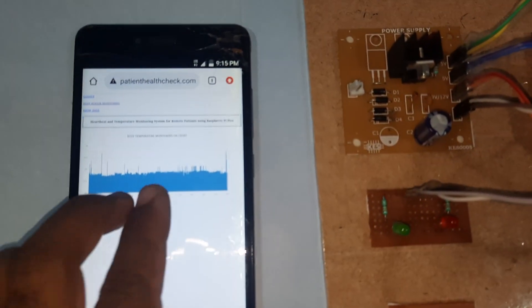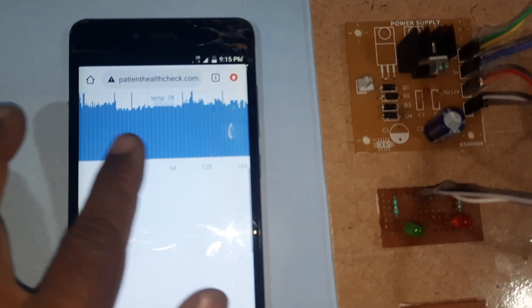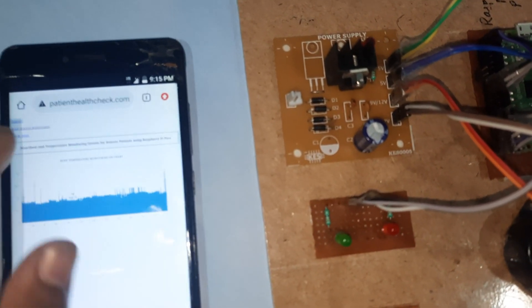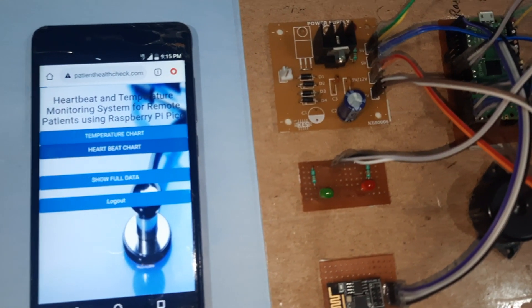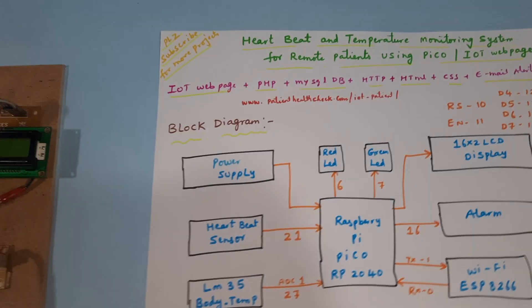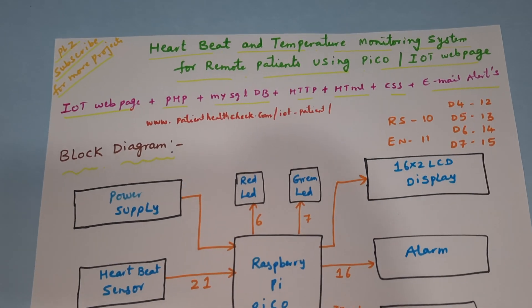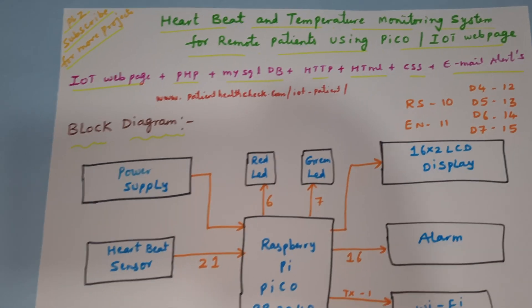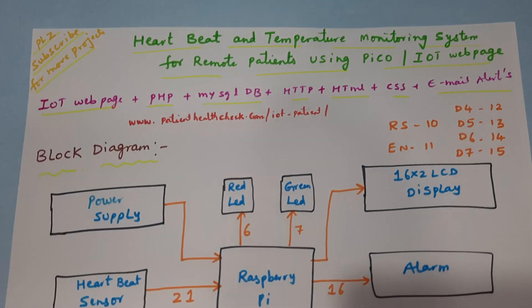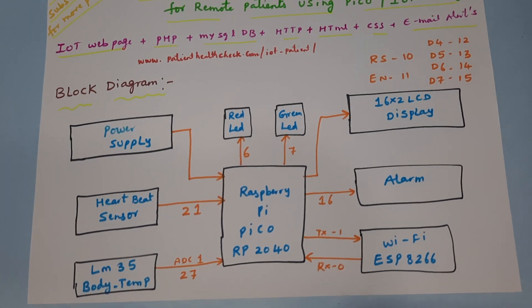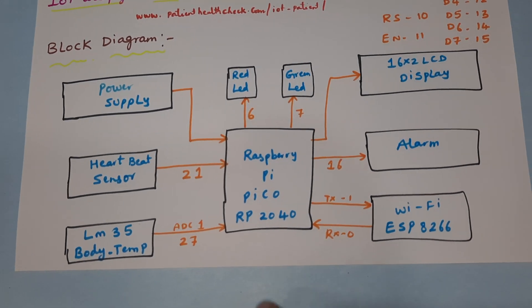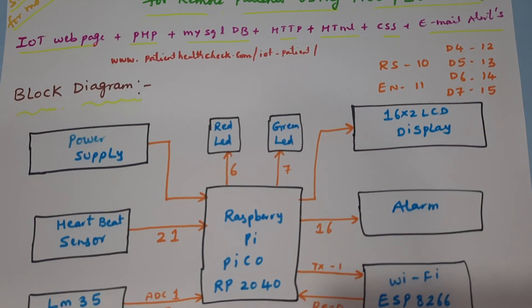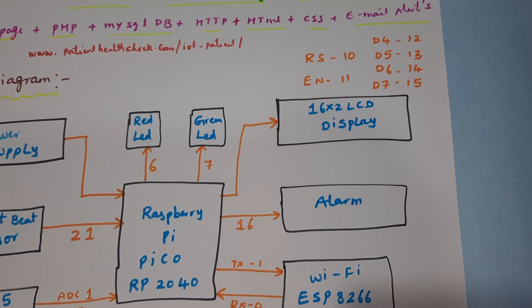It will work over mobile internet. This is the data of temperature, and we can monitor the heartbeat data also. Coming into the block diagram — this is the Patient Health, Heartbeat and Temperature Monitoring System for Remote Patients using Raspberry Pi Pico. Here we are using a 5-volt power supply module.